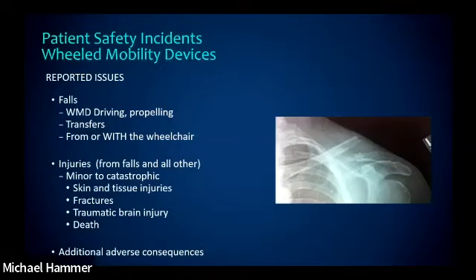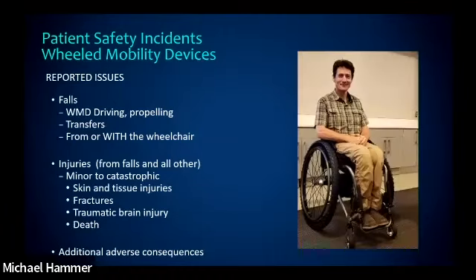Okay, but looking at, of course, this clavicle fracture, orthopedics and physical therapy is my background. Not such a big deal. It hurts a lot, but most people heal up from a clavicle fracture without surgical intervention. So the outcomes are pretty good. Very different scenario when the individual experiencing that fracture is a manual wheelchair user or using assistive technology in any way. And it really carries a significant implication, of course, for the clients that we serve when they are now experiencing a catastrophic injury as a result of an adverse consequence.